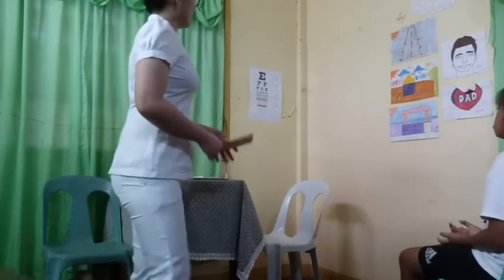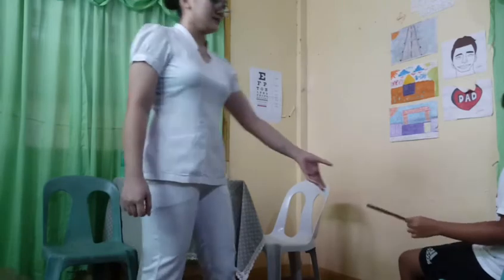Can you please read the line of letters that are visible to you? Number 8, B E F P O T E C. Okay, can you please cover your right eye? B E F P O T E C. Okay, now your left eye. B E F P O T E C. Okay, very good. Okay, so the client has a 20/20 vision.